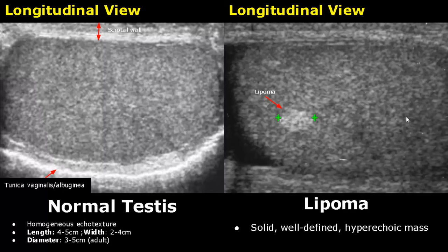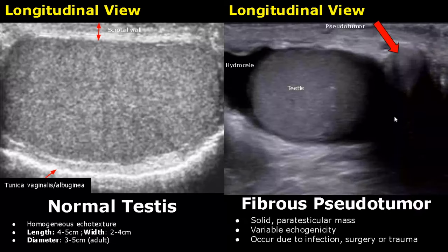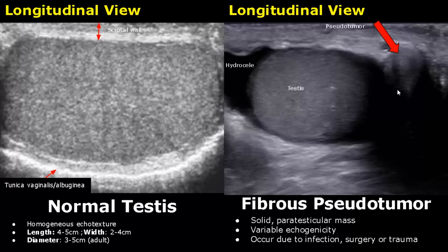A lipoma in a testis will appear as a well-defined hyperechoic mass without any posterior acoustic shadowing. Fibrous pseudotumor is found outside the testis as a solid mass with variable echogenicity. We can distinguish it from tumors and cancers by looking at the cause — it occurs due to infection, surgery, or trauma.